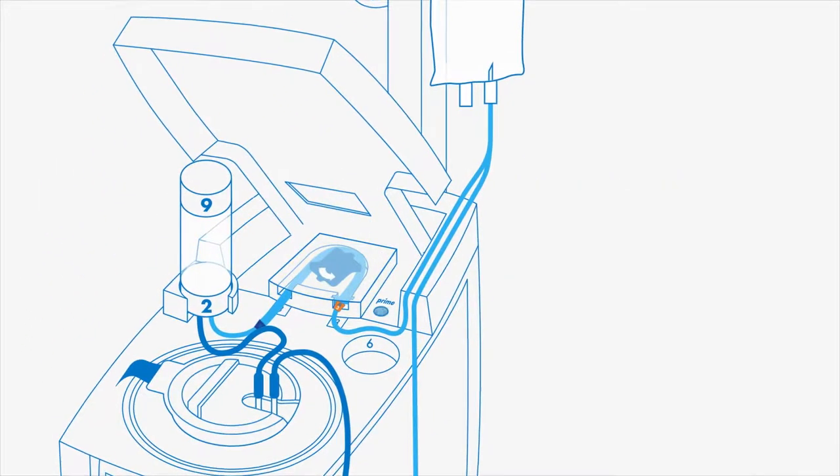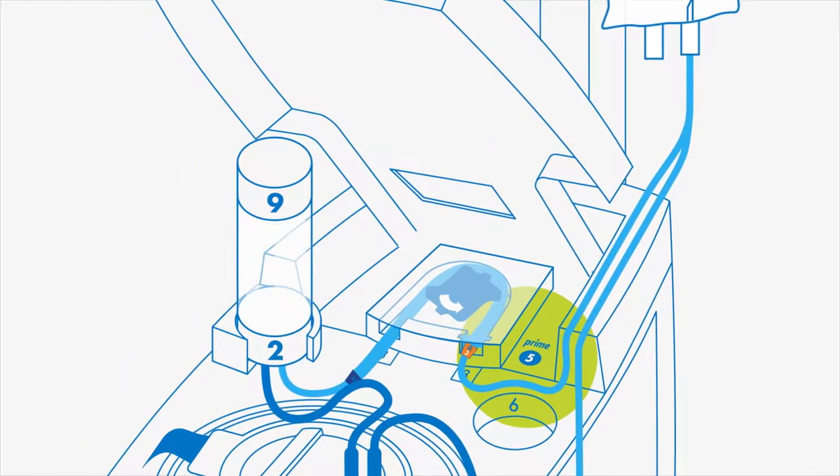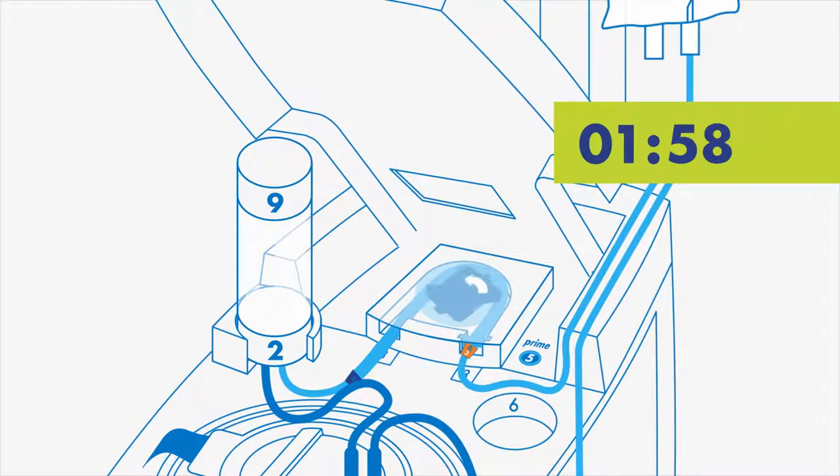Press and release the button labeled Prime, blue number 5. The button will light up. After 5 seconds, the pump light will come on and the pump will turn for 2 minutes to prime the tubing.